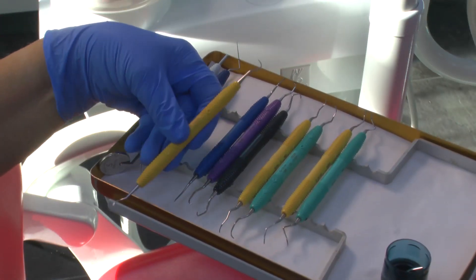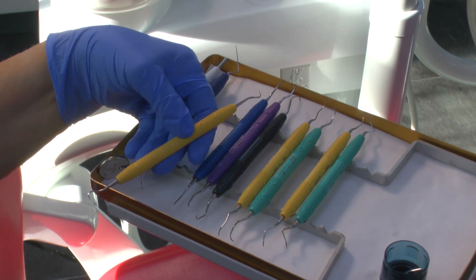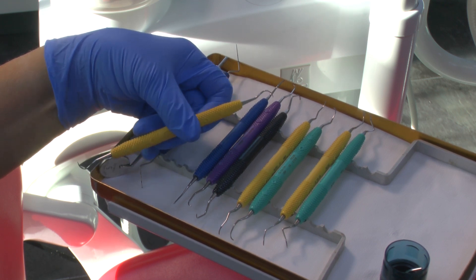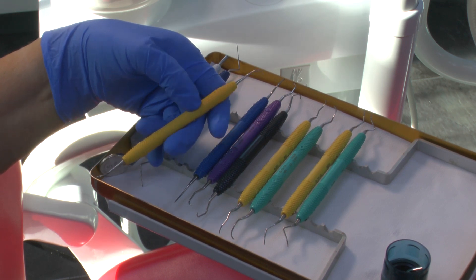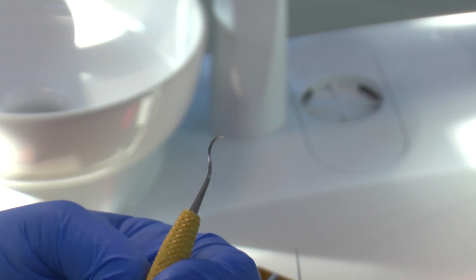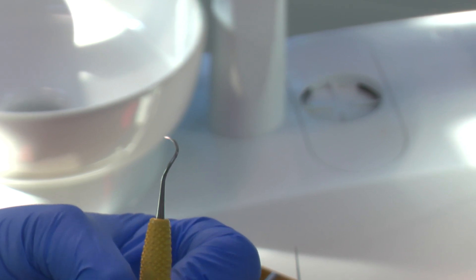This is my favourite instrument, another PDT. It's called a Montana Jack and as I turn it you can perhaps see there's a little rake on the neck, and that helps you get access not only to the anteriors but quite far back in the mouth. It's got a very fine tip so you can get into mesials and distals where your ultrasonic tip might be too thick.